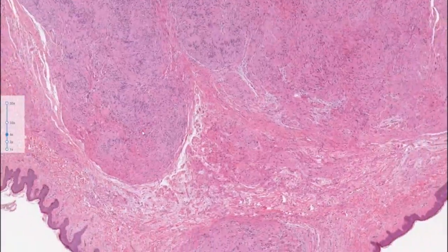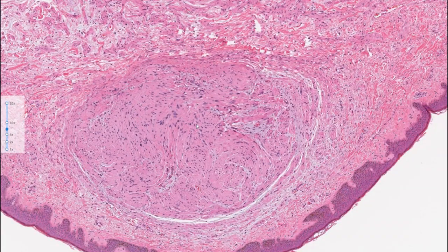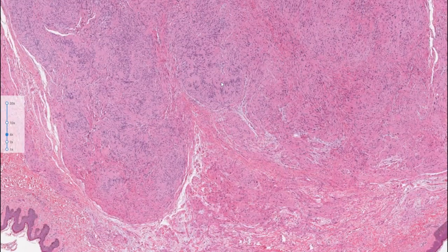What is really, of course, unusual here is that you have multiple nodules, not a well-formed capsule, and a bit more of a diffuse pattern of growth in some areas almost. So this patient, and this is why this case is relevant, was actually, a while back, diagnosed with neurofibromatosis type 1, and that was because of these tumors. These tumors were called plexiform neurofibromas in the past, and it's not. These are actually plexiform schwannomas. That exists. It's something important to have in mind.